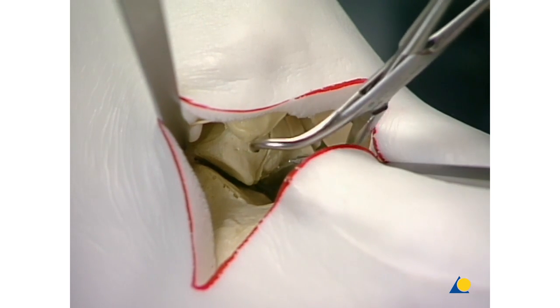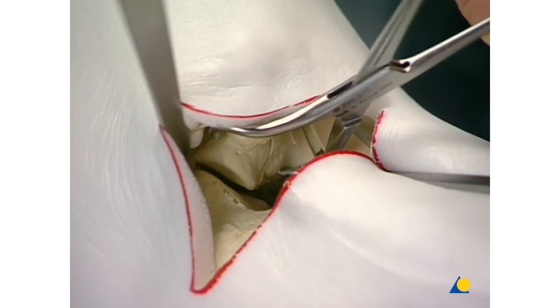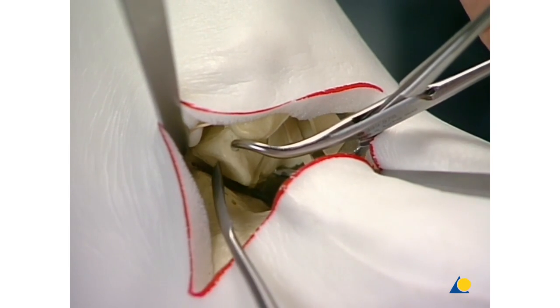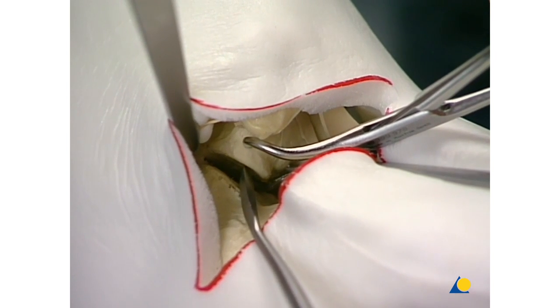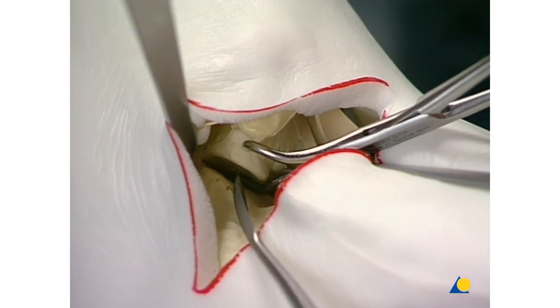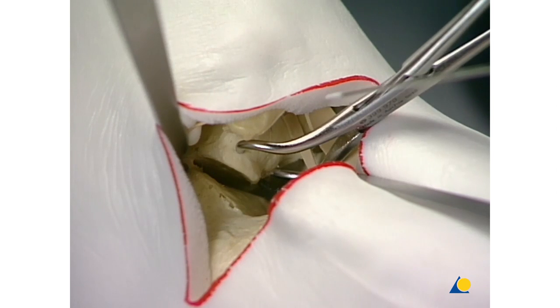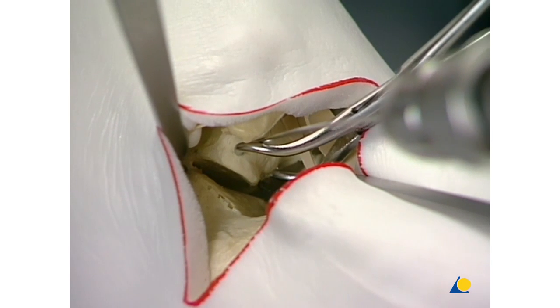Reduction using a small reduction forceps. Temporary fixation using a 1.6mm threaded K wire.